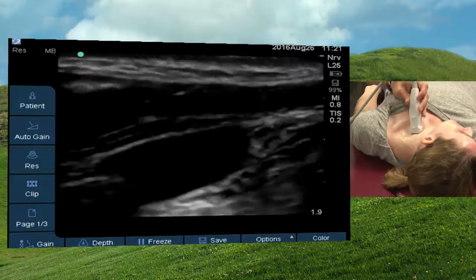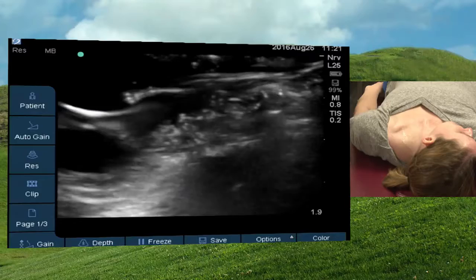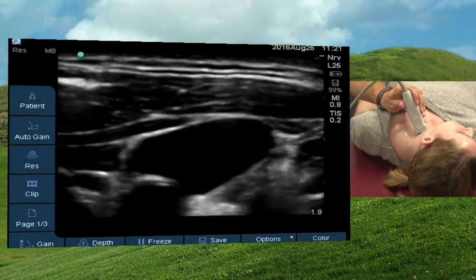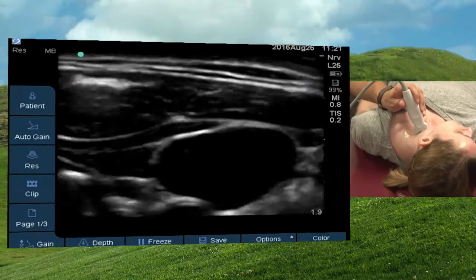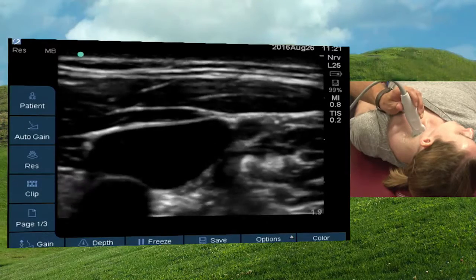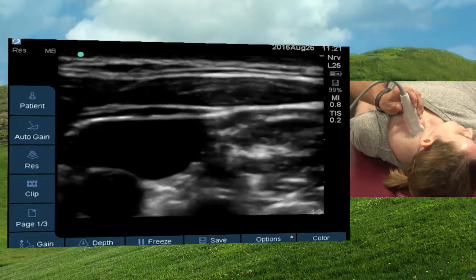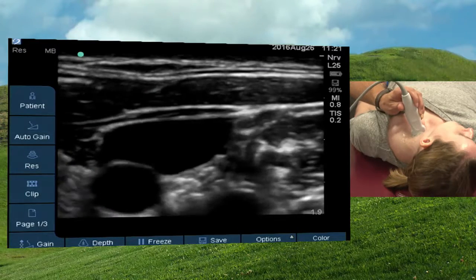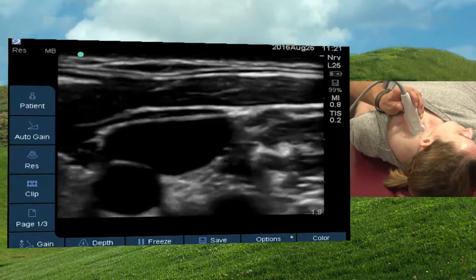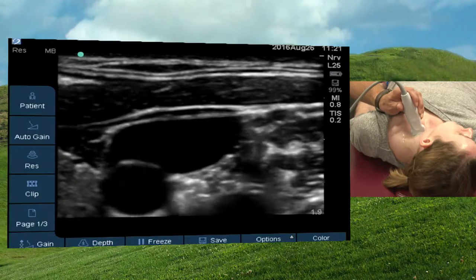So we're going to lift Beth's legs up here, increase blood flow. Let's see what that does. There we go. So it's definitely distended a little bit from when we had our legs down. So this is one reason for considering putting your patients in Trendelenburg. The other reason for considering putting your patients in Trendelenburg for a central venous line such as this is to help to prevent air embolism.